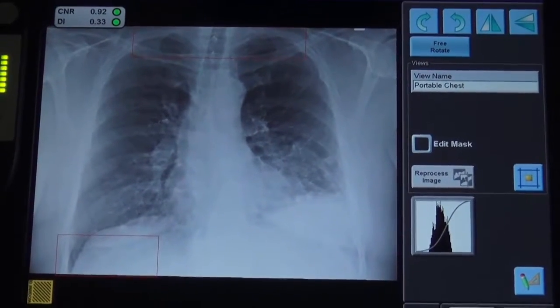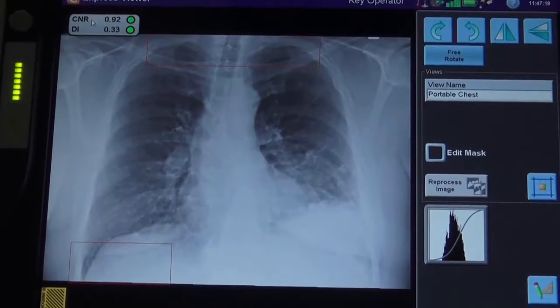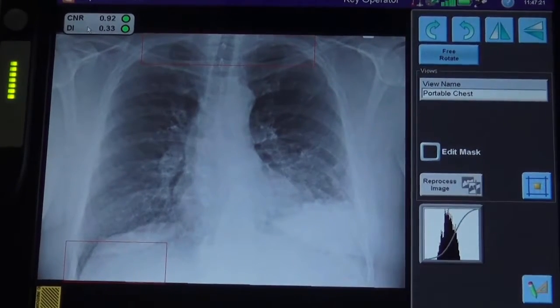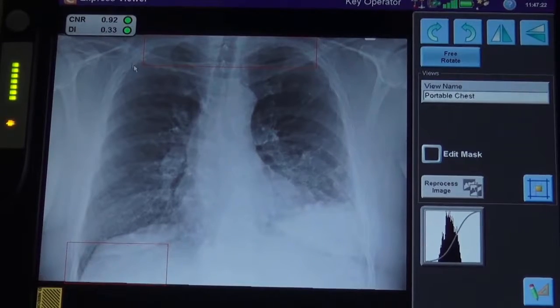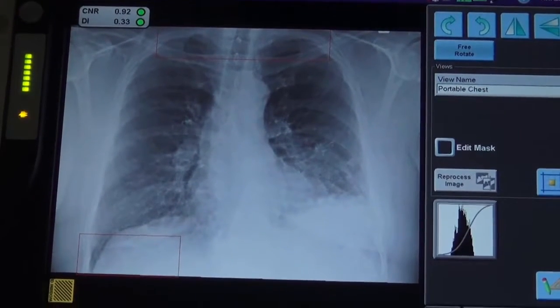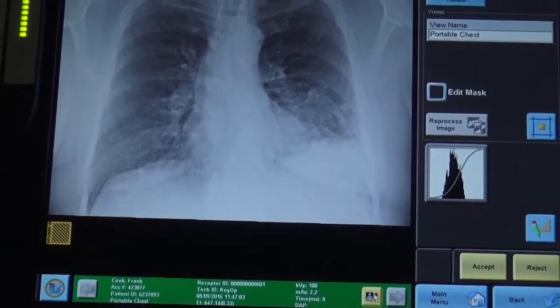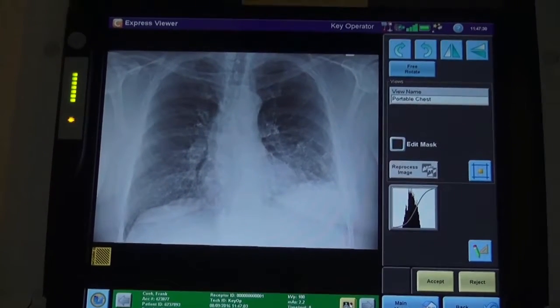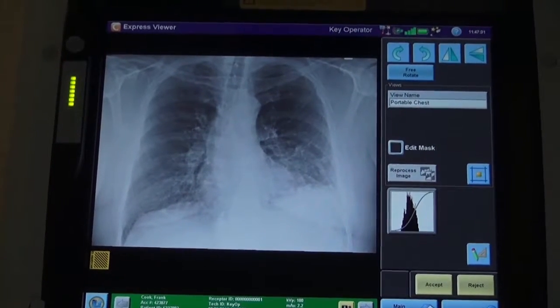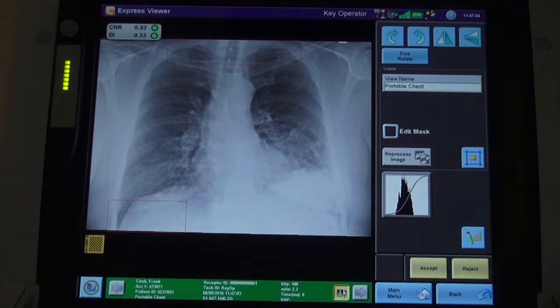Tech Assist also provides a contrast to noise, or CNR, value along with the deviation index, or DI, value. CNR is a measure used to determine image quality. CNR is similar to signal to noise ratio, whereas as contrast increases, the noise decreases. This is important when there is a significant bias in an image, such as from scatter.